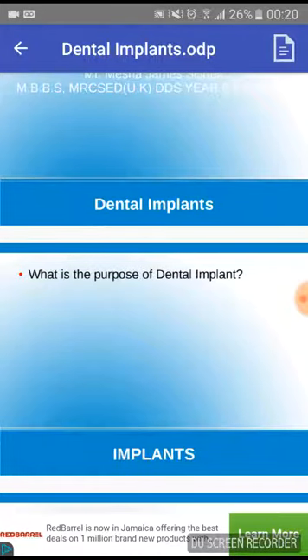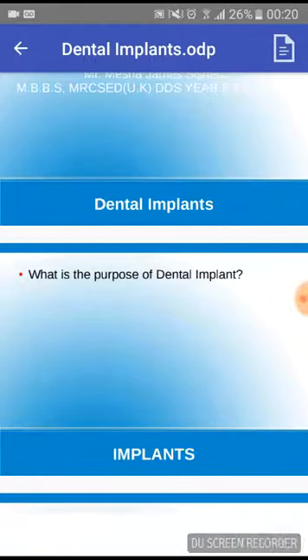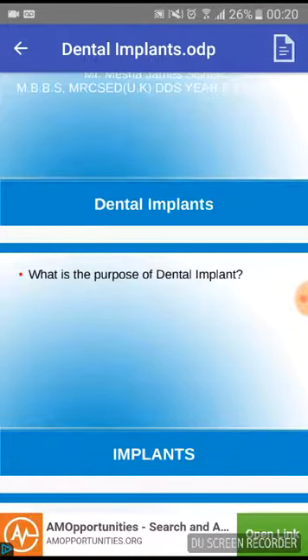So we're going to talk about the 2-step method, which is first, you have to prep the patient. Usually give them antibiotics and painkiller, then a local anesthetic is given. Sedation, which can be given via the intravenous or oral route, can also be used. An incision is made at the area where you want to put the implant, and the gum itself is cut to expose the bone. A hole is drilled and the implant placed.